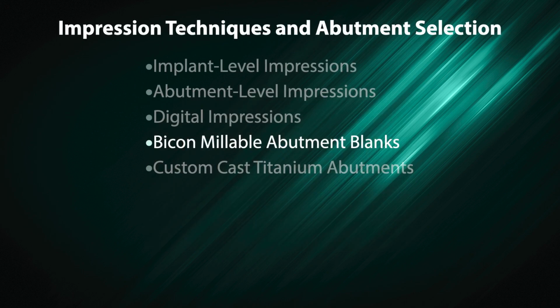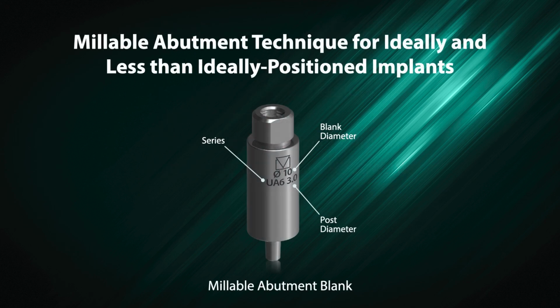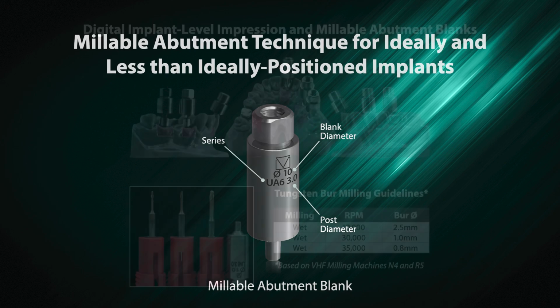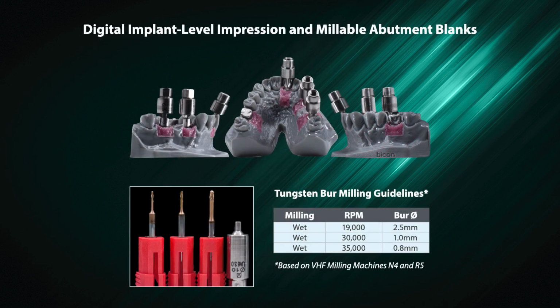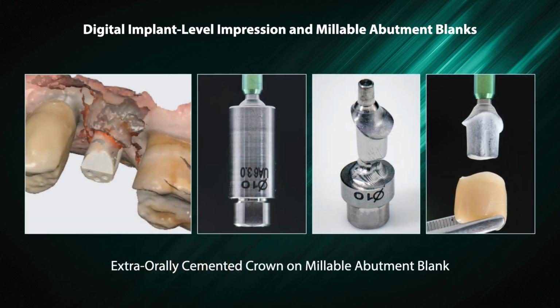Bicon millable abutment blanks. Millable abutment technique for ideally and less than ideally positioned implants. Digital implant level impression and millable abutment blanks. Extra-orally cemented crown on millable abutment blank.